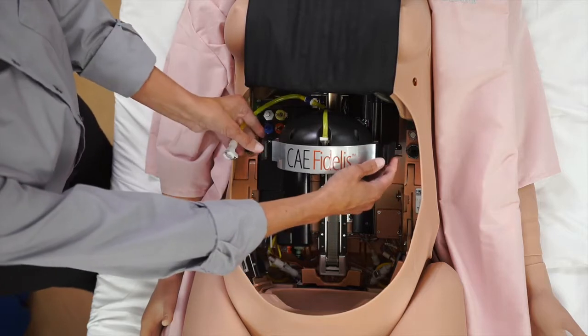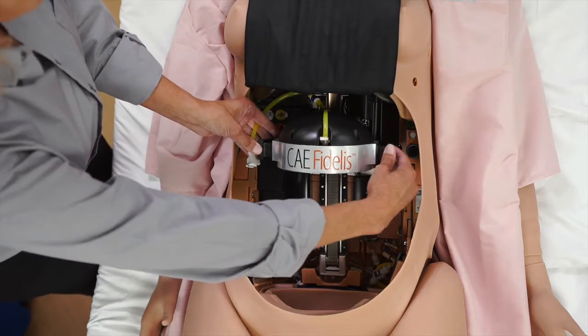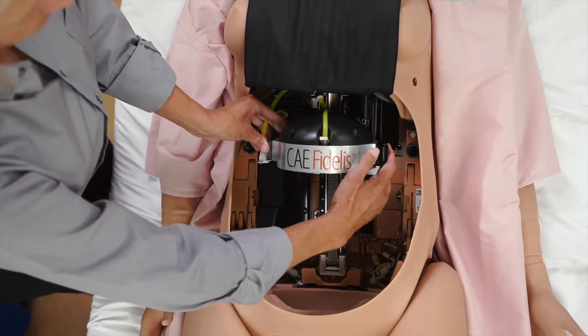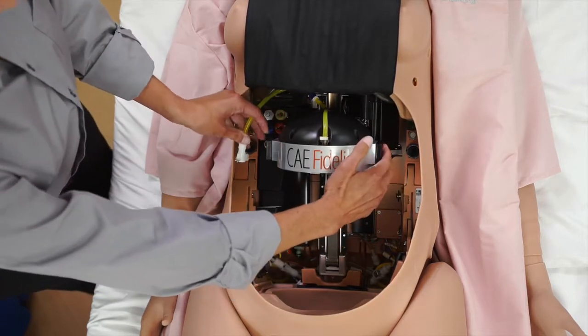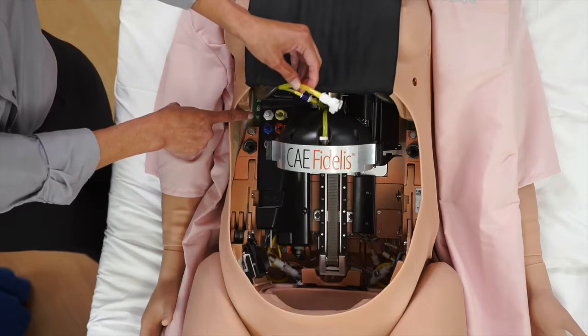Ensure the side connection rings are fully inserted and aligned. Latch the bottom of the clip to the rotation ring and push the top of the clip in to securely fasten. Connect the yellow compression tubing on the rotation ring to the compressor connection on the baffle.